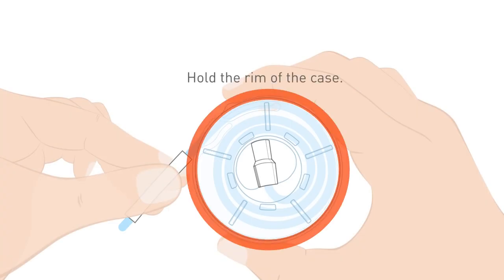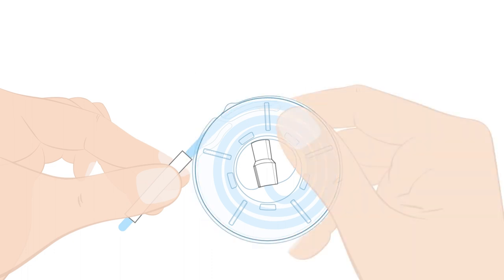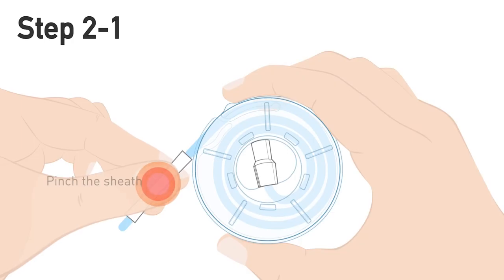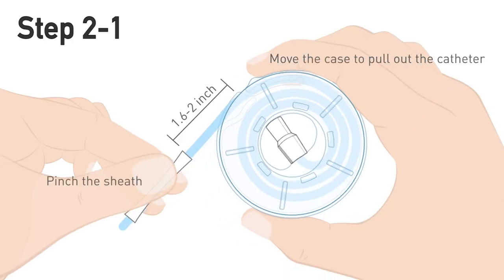Make sure you hold the catheter by the rim. Holding or pinching the body of the case will block the catheter from being pulled out. Use the sheath to gently pull the catheter out of its case.